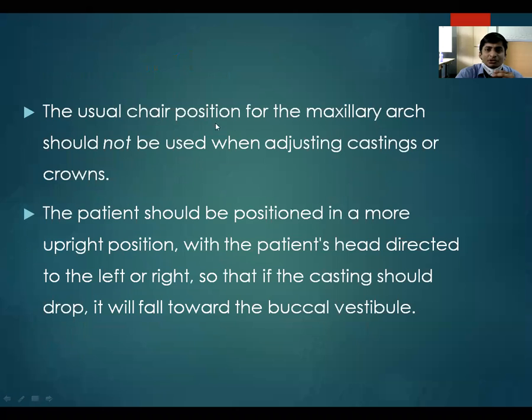The usual chair position for the maxillary arch should not be used when adjusting the casting or a crown. So usually we use a supine position while performing treatment on the maxillary arch. But this supine position should not be used when you are trying different castings or a crown. Suppose you are placing a crown, you should not use a supine position. The patient should be positioned in a more upright position with the patient's head directed to the left or right, so that if the casting should drop, it will drop into the buccal vestibule.